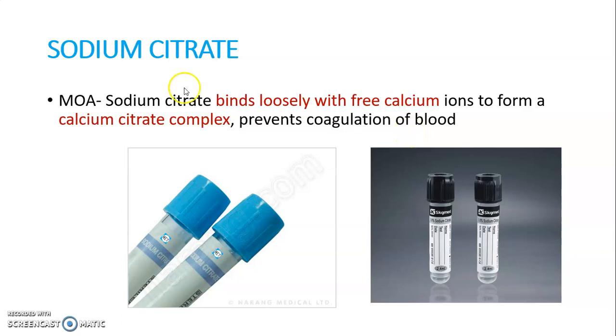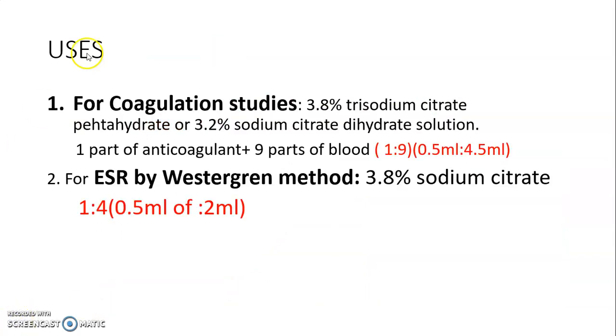Sodium citrate anticoagulant is present in the light blue topped Vacutainer, and also in the black-topped Vacutainer. The first use of the sodium citrate Vacutainer is in coagulation studies.